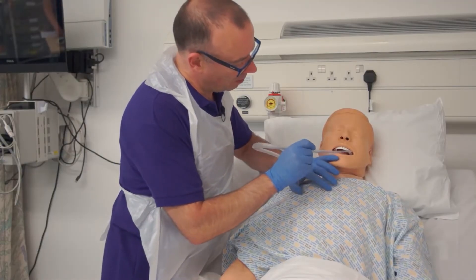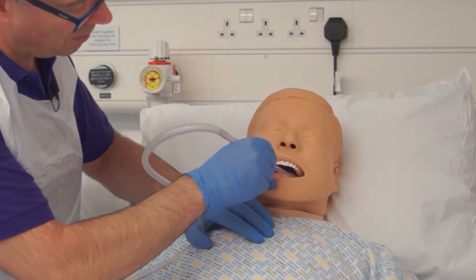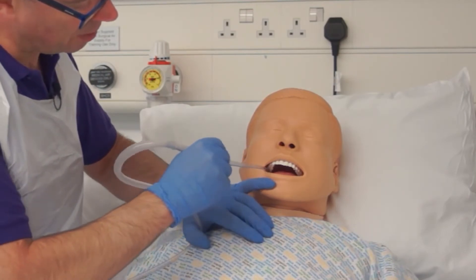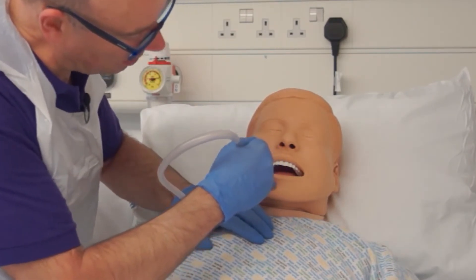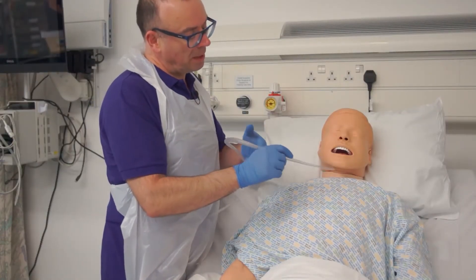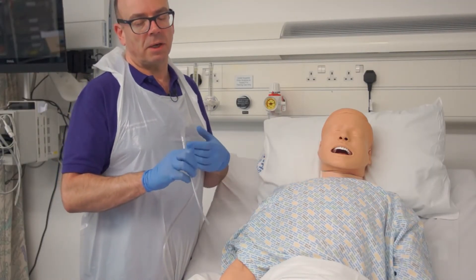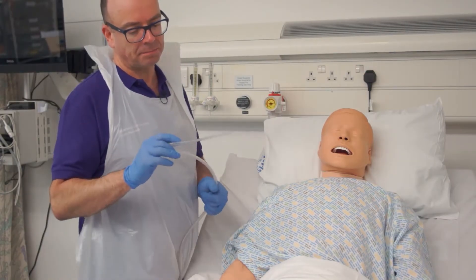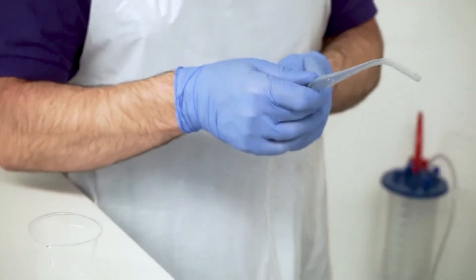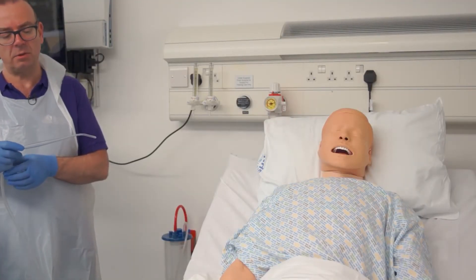Bob, I'm going to help you clear those secretions now. Gently passing the catheter into the cheek pouch — the suction pressure is on at all times — coming back out across the tongue and down into the other cheek pouch, making sure I can see where the tip of the catheter is at all times. Avoid going over the midline as you'll make the patient gag, and keep the suction sweep down to about 10 seconds. Unlike the flexible catheter, we can reuse this one for up to about 24 hours, whereas the others are single use, and we'll clean it through with some water.